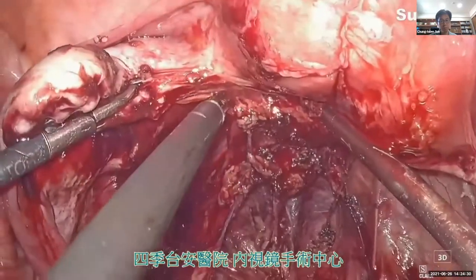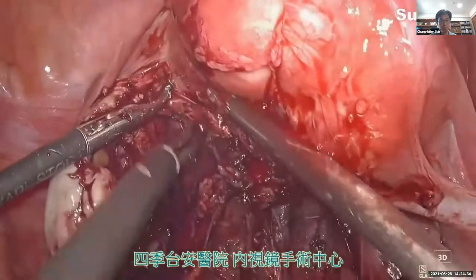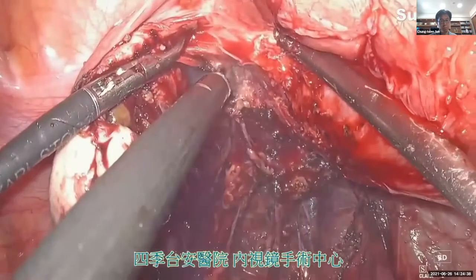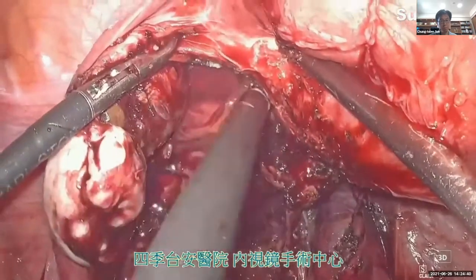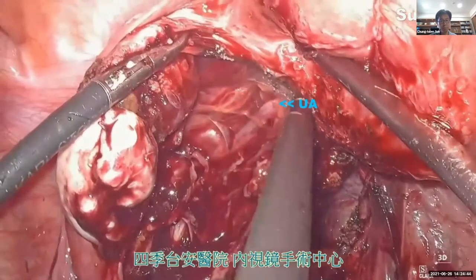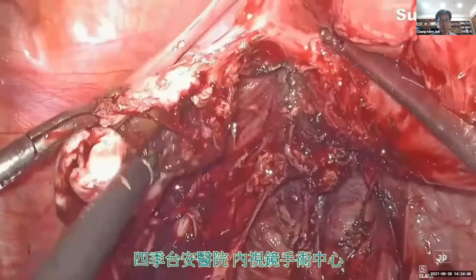Now we isolate the ovarian ligament further to make a complete separation of the ovary away from the uterus sidewall and uterosacral ligament. Now the left ovary is totally free.